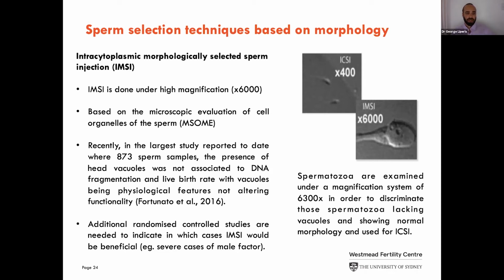In a recent study of 873 sperm samples, the presence of head vacuoles in the sperm, as we can see here, a couple of head vacuoles, was not associated with DNA fragmentation and live birth rates. Vacuoles were shown to be physiological features, not affecting the functionality of the sperm. Of course, more randomized controlled studies are needed, and we're going to cover the effectiveness of IMSI.